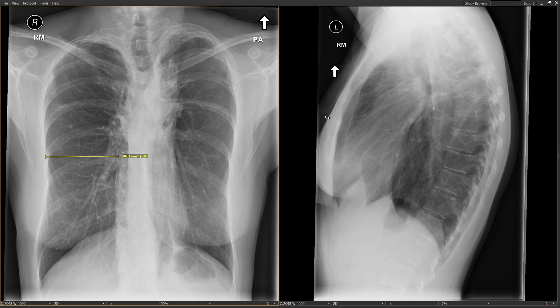Let's take a look at the lateral view. On the lateral view, our landmark is the lucent circle of the left upper lobe bronchus, and that is also too high. Just as we saw the hila retracted upward on the frontal view, this is a sign that the hila are retracted upward on the lateral view as well.